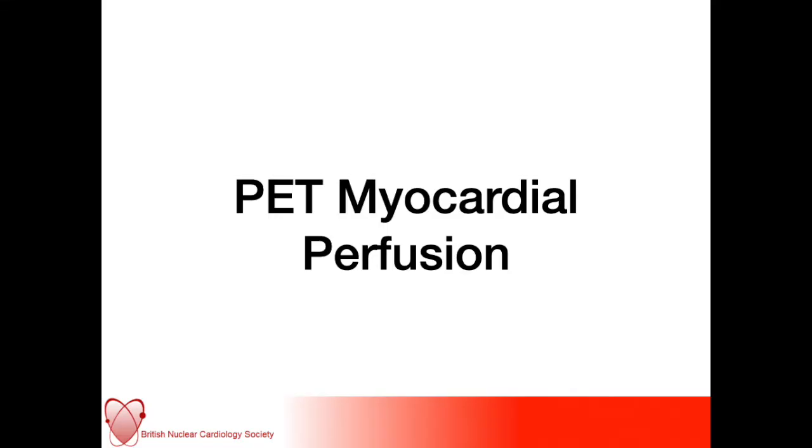the SPECT perfusion agents. So there are imaging considerations and some practical considerations, but this is why you may request a thallium scan and you actually might get back a MIBI scan or a rubidium scan. These tracers have been largely shown to be equivalent, and there are inherent superiorities with the PET tracers over the SPECT tracers.